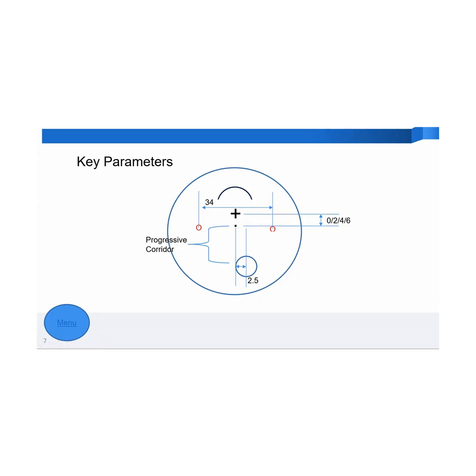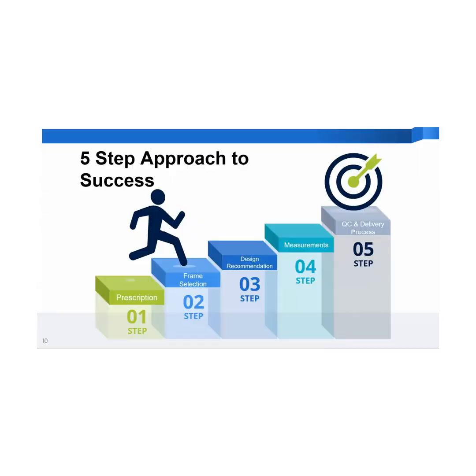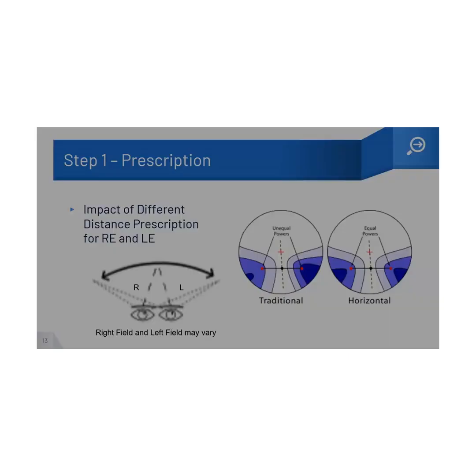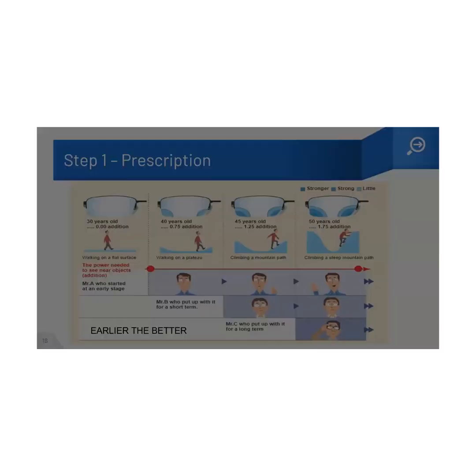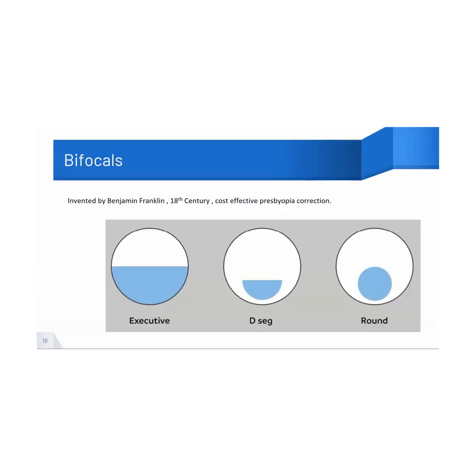Today, we are going to speak majorly on the frame selection and also how the design will impact the frame selection. Before getting into the details, I would also want to touch base on one aspect, which is bifocals, right? I'm just moving on with my slides. I'll just share with you on the bifocals.